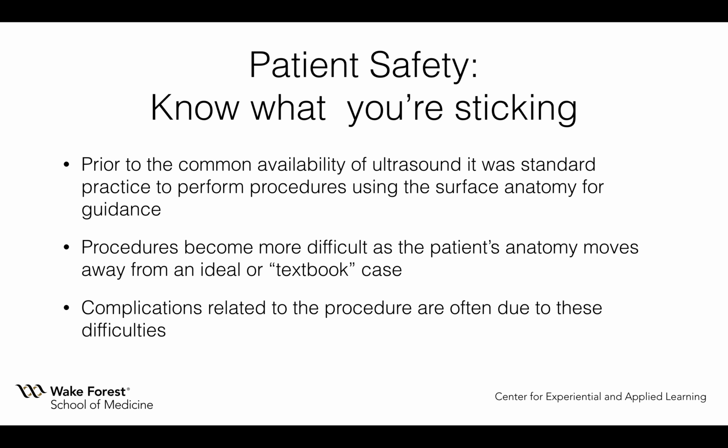So, before ultrasound became widely available in small compact machines, most bedside procedures were done based on surface anatomy. And as patients deviated from a standard ideal patient, their procedures became more difficult to complete. And when ultrasound became available at the bedside, pretty quickly we realized that it facilitated these procedures and allowed us to complete them faster and with fewer complications.